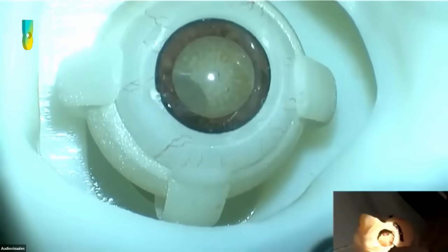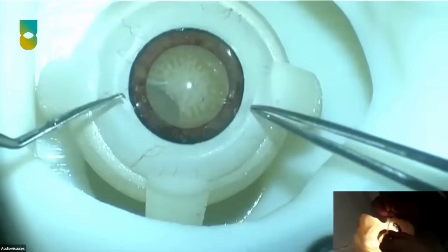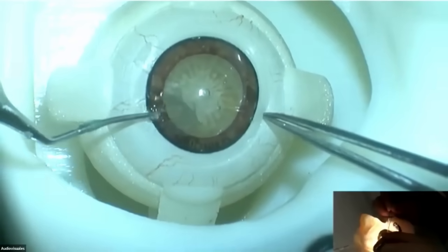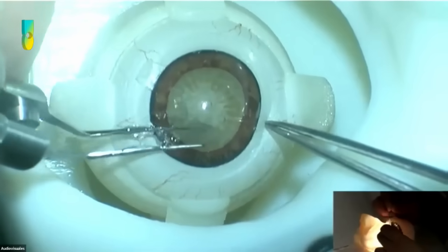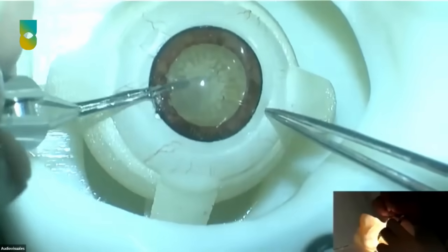You can take your Drysdale or any other instrument in the paracentesis, and that is going to work very well to fixate the eye without causing pain for the patient, which is going to make him or her move. That's a very good input from Pablo Robles.